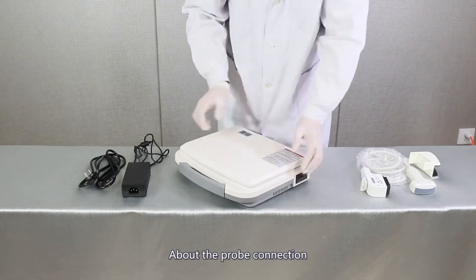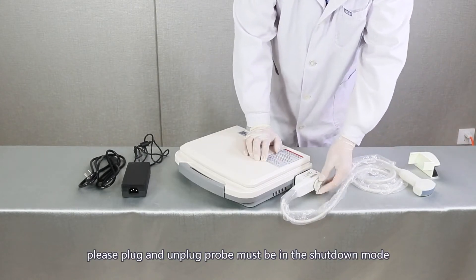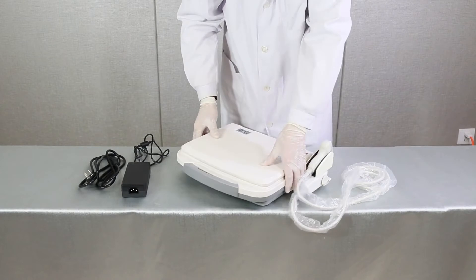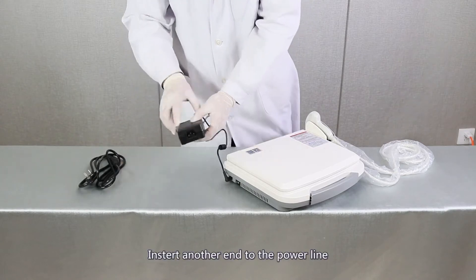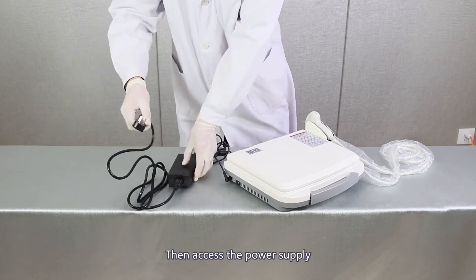Instrument installation. About the probe connection: plugging and unplugging the probe must be done in shutdown mode. Lock up the probe after plugging it in. About the adapter connection, insert one end into the charging port, insert the other end into the power line, then access the power supply.